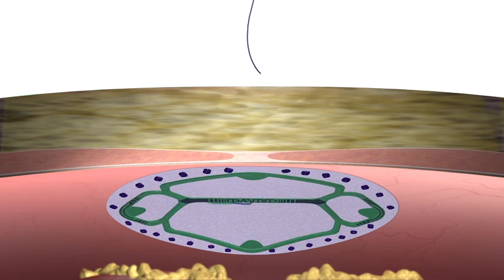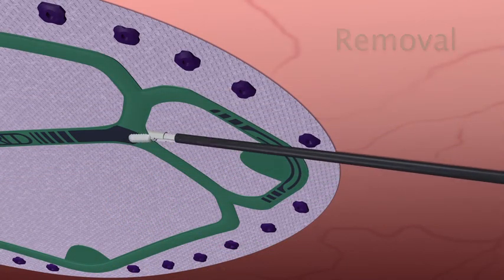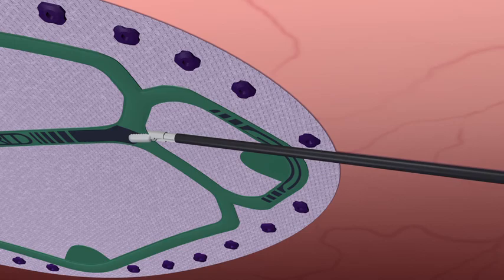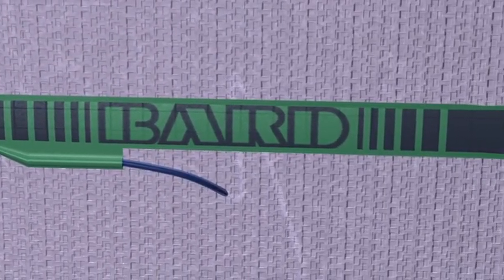The ECHO-PS Positioning System is quickly and completely removed from the body. To initiate the removal process, a grasper is used to grasp one of the removal points, clearly marked by the arrows adjacent to the BARD logo.